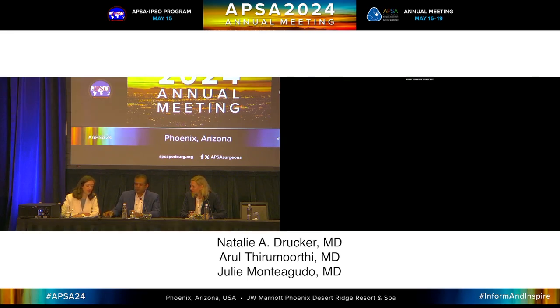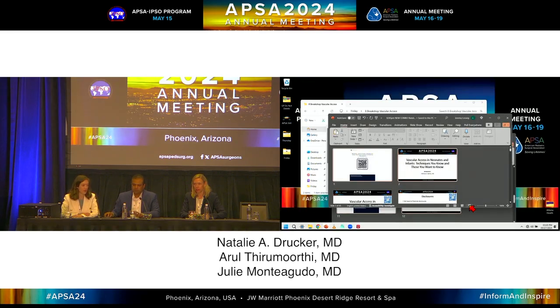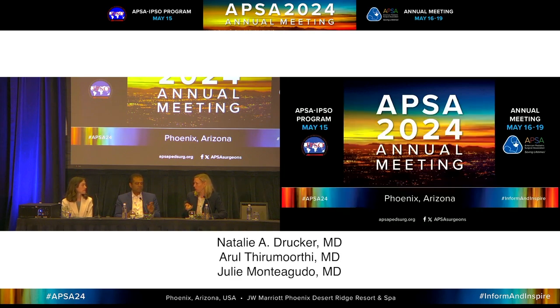All right. We have a few minutes for questions now, and maybe while people are thinking about their questions, I'll ask Natalie if you have any problems with recirculation with the hemodialysis catheter. We do, but it doesn't seem to matter too much. We're able to get enough filtration and pull off enough fluid to not have it be a problem. Most of the dialysis lines for babies are like that. They all have the reinfusion and the drainage at the tip, because the two-stage ones are too long for babies. So it's not any worse than the bigger dialysis lines that we were trying to put in before.